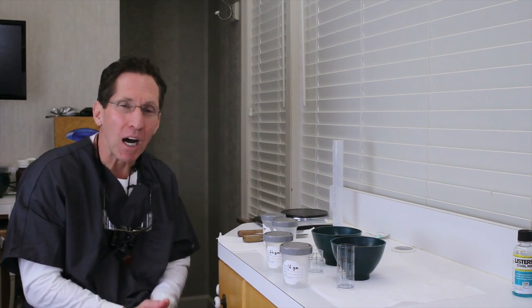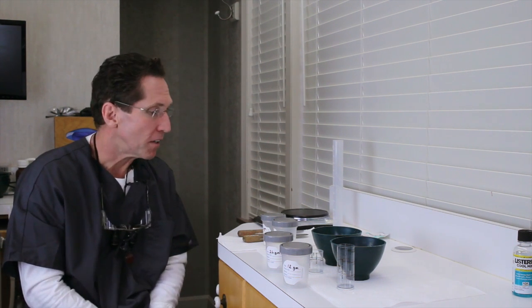Okay, I'd like to talk a little bit about, actually quite a bit about the alginate. The alginate is really what this whole video is about. And a lot of little details, a lot of little important details to cover in this portion of the presentation, this part of the technique portion. In any event, the first thing we're going to talk about is the fact that, as we alluded to earlier, we're going to use 2 viscosities of alginate impression.